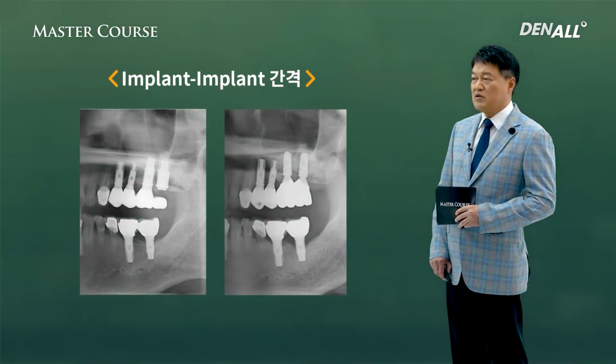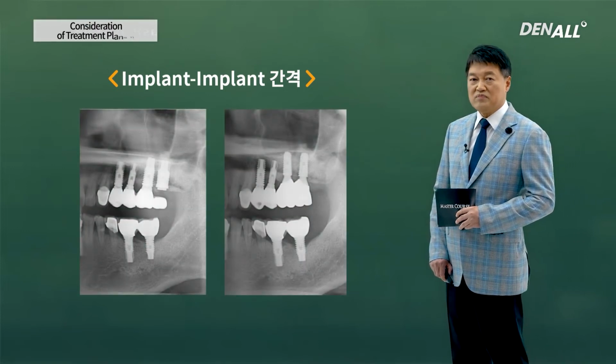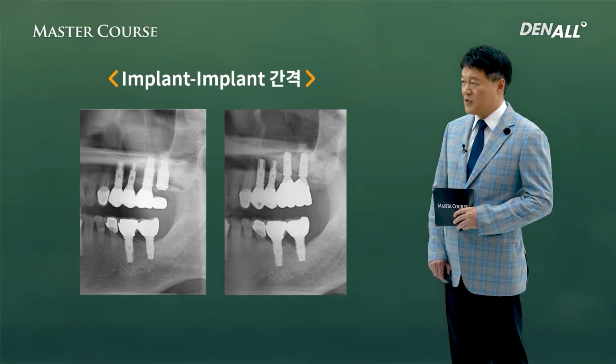In number 6 and number 7, you can see that the implants are very close to each other and resurgery was required. We did surgery again after securing the space that was needed.